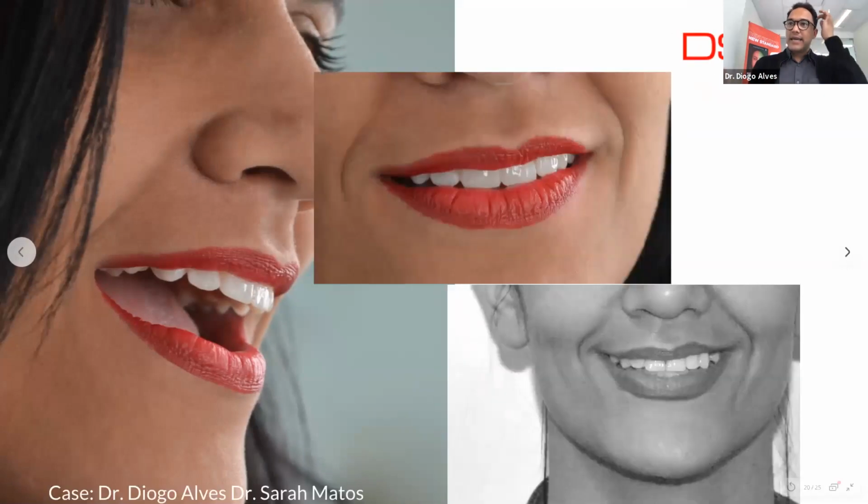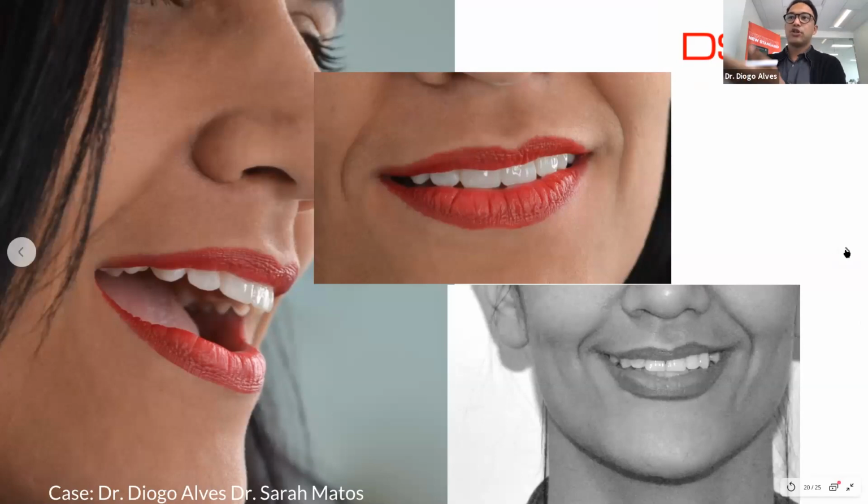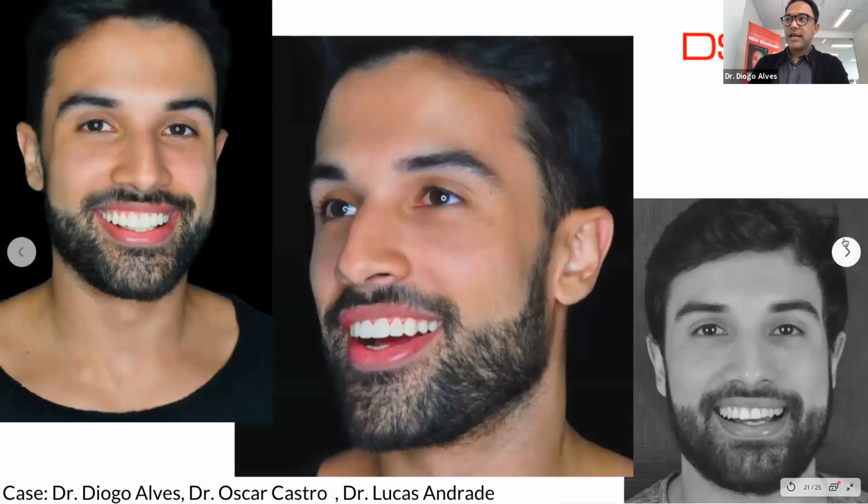Here we have my case, and if you guys notice the grooves in the anatomies, I didn't have to do a thing there. All that I had to do was the finishing and polishing, but I didn't change any of the anatomy because the anatomy was already done in the app. It was already there. Looks so natural. Natural shapes. That's correct. That's what we want to do. We want to make composites that look like real teeth. Right? It looks harmonic. It looks beautiful. We have here another case, 10 composite veneers done with DSDApp.